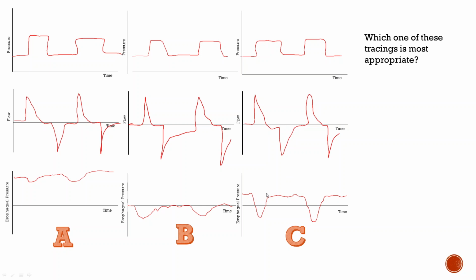The other thing you can do is to prevent atelectotrauma. So this is another thing you can use to help guide what your PEEP setting is going to be. And your PEEP, again, is to help prevent atelectotrauma. So where you want to set your PEEP is at the level of whatever pressure is closing down your alveoli at the end of expiration, right? Your PEEP is to keep alveoli open at the end of expiration.